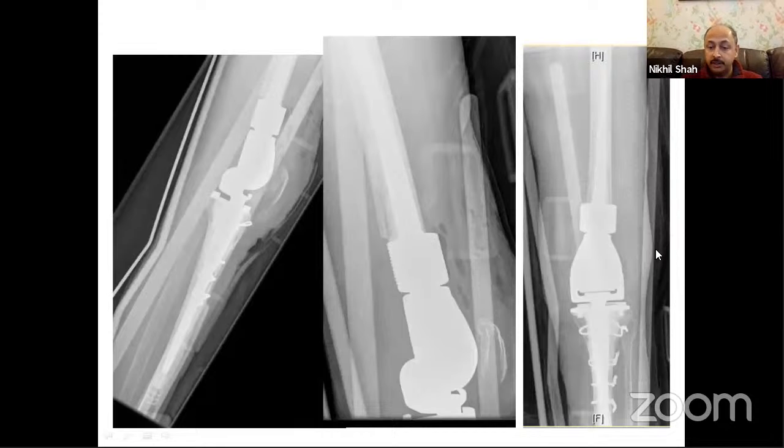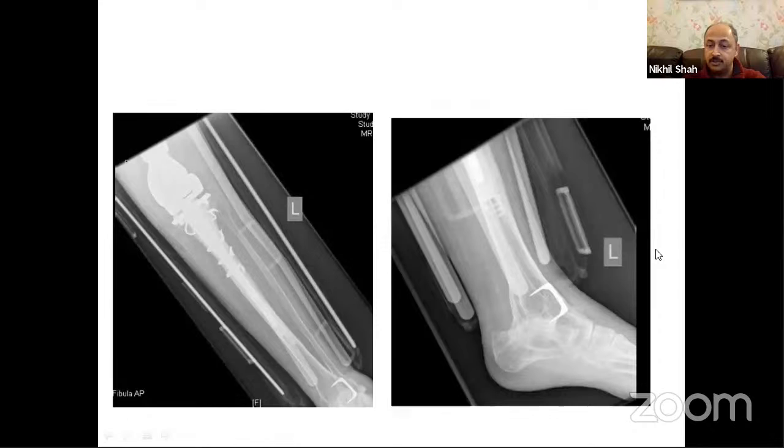You can see that the TTO goes really, really long. The mistake is to do a short TTO. That causes a lot of problems. And then you go for a long TTO, and I went for a distal femoral replacement with a collar that is coated with HA. This is the Stanmore prosthesis, and a very long stem that goes beyond the TTO and gets good fixation. And that is the follow-up, and the patient's doing quite well.